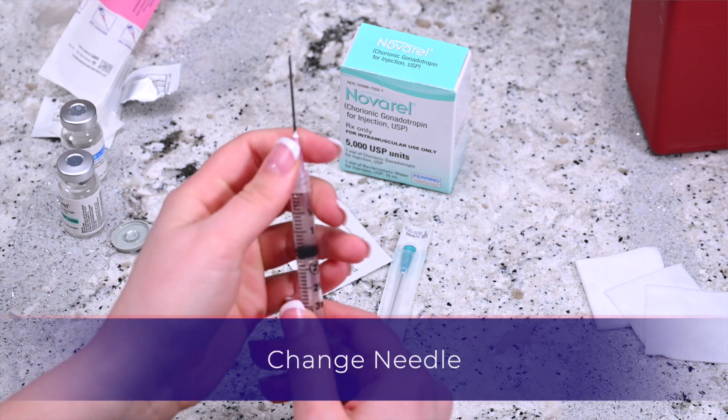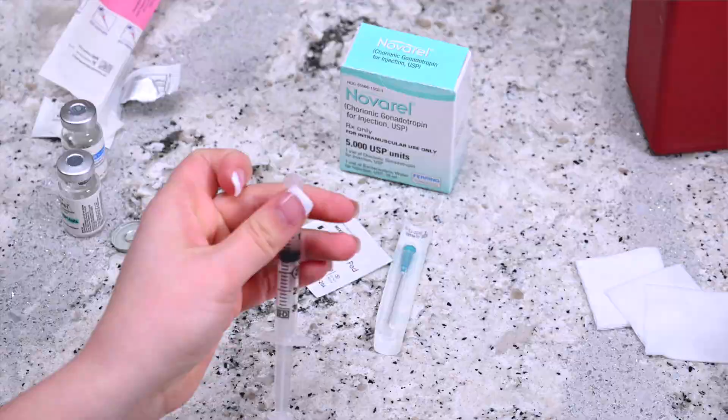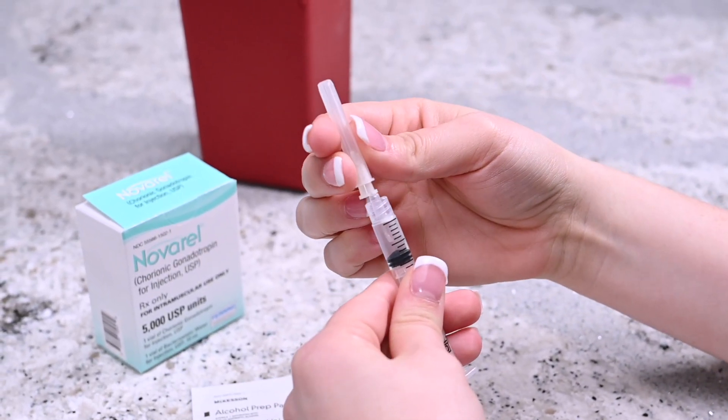Gently twist and remove the needle from the syringe. Dispose of the needle, placing it into the sharps container. Attach the subcutaneous needle and remove the cap.